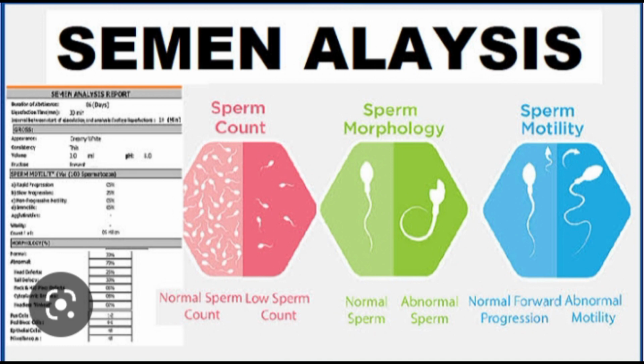Viscosity. Freshly ejaculated semen is highly viscous. Self-liquefaction takes place and should be completed in 15 to 30 minutes. The absence of liquefaction may inhibit the movement of spermatozoa. Color and odor. Normal semen is whitish with a typical seminal smell. A suppurative infection imparts a foul smell and a yellow color.